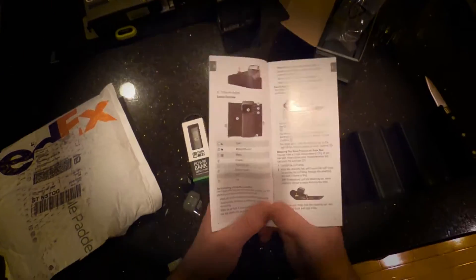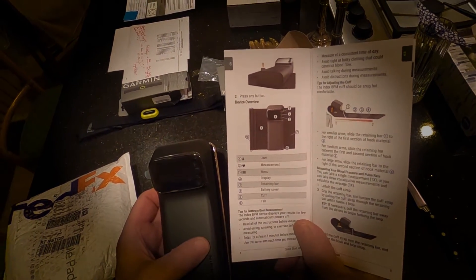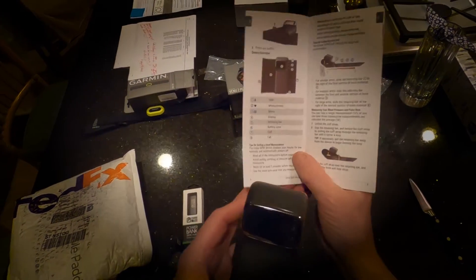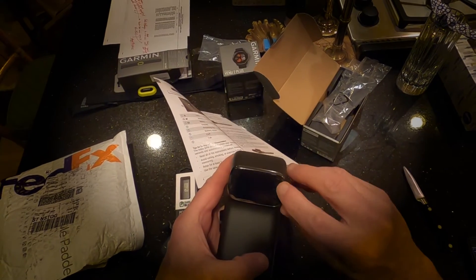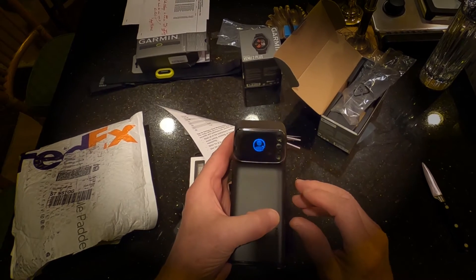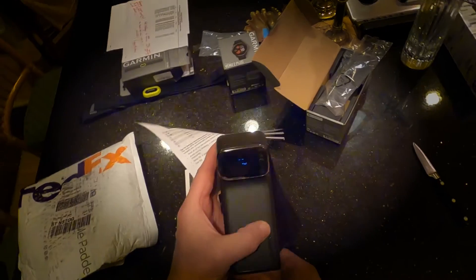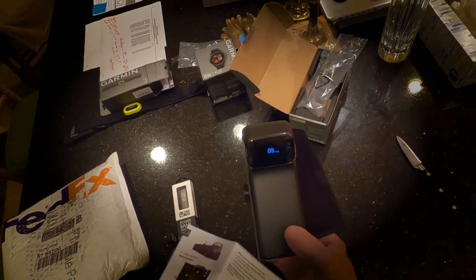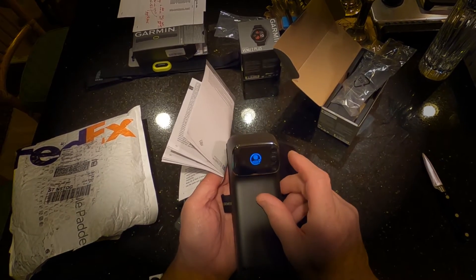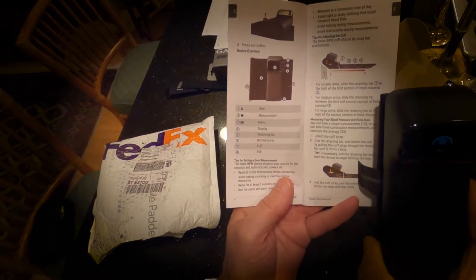That button doesn't work. It must be a button on here — like one, two, or three. Now it's going to start... I guess it wants to know something here.